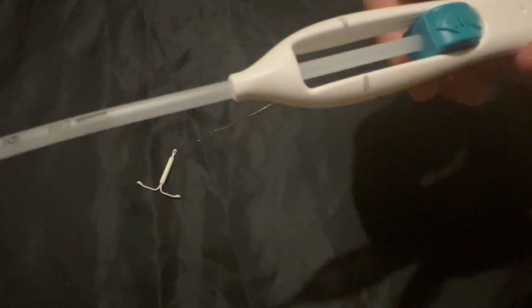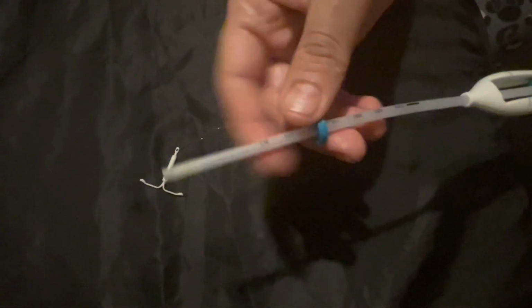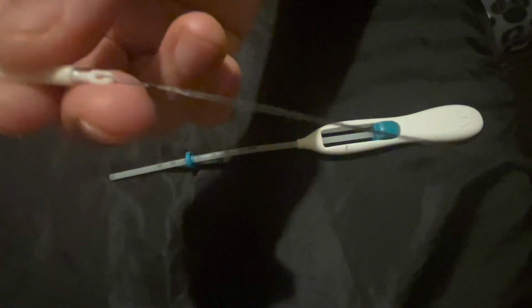As you can see, the whole coil came out of the tube, and once you have done that, you can't reload the coil again. Okay, so let's repeat those steps from the slider. First here, and then release the arms by doing that and take it out from here. Okay, this part of the coil contains the hormone, and these threads can be trimmed after we insert the coil.